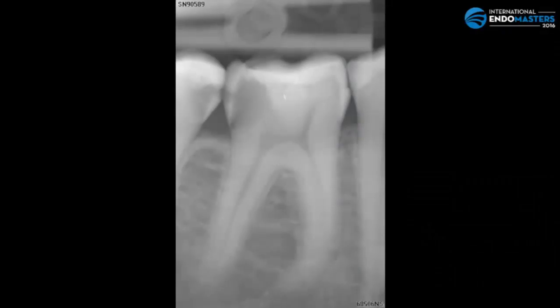This is a lower molar with a very abrupt curve in the distal canal. So I was following my protocol, establishing my glide path with M4 using the file number 8, number 10, and number 15, and then I started to use my small procedure package.